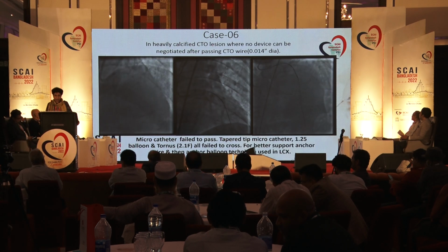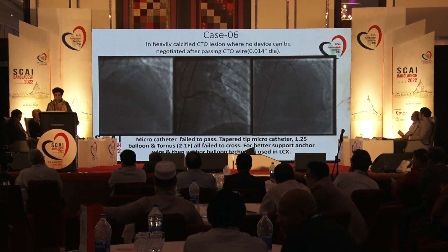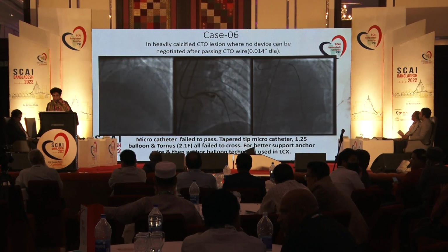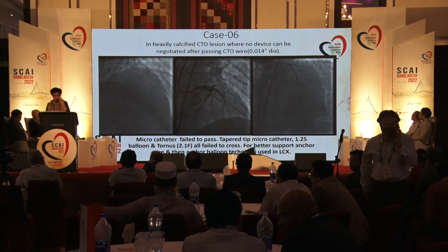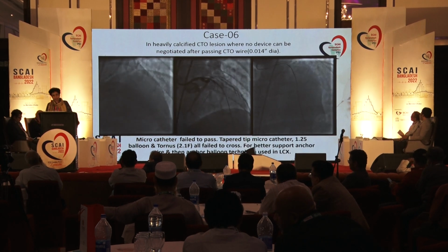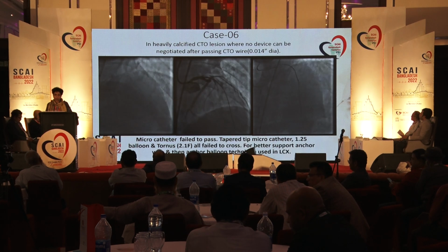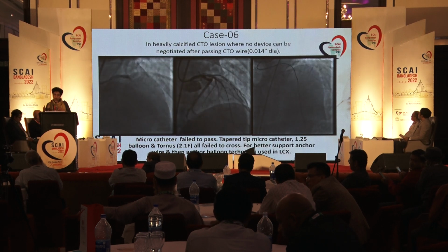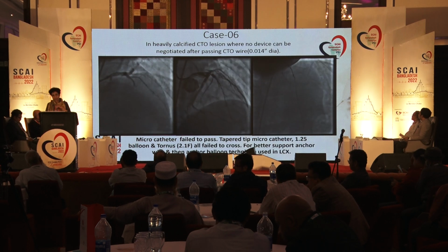Unfortunately, a microcatheter would not work. So we changed the microcatheter and took a Caravel. It would not work. We then tried to take a very low profile 1.25 balloon and try to create a sliver of space there. Our balloon would not go. We tried with the Tornus. We did the anchor balloon technique to the LCX. Nothing would work. So there we were stuck with the wire, a Confianza wire in our CTO that we managed to open, but our microcatheter won't go.